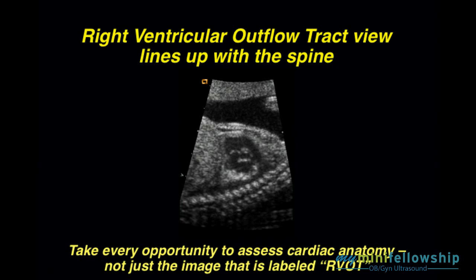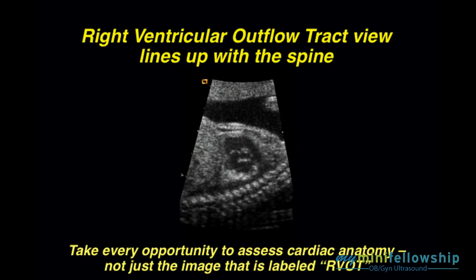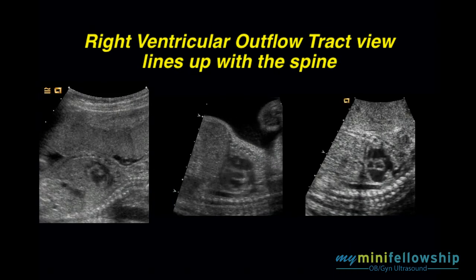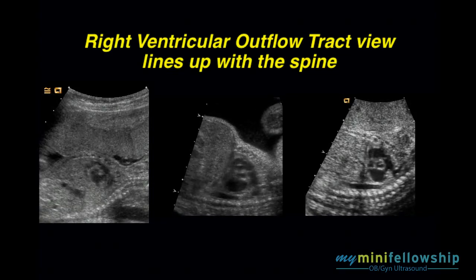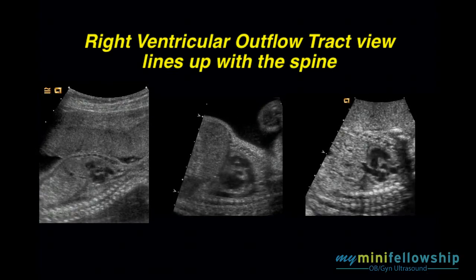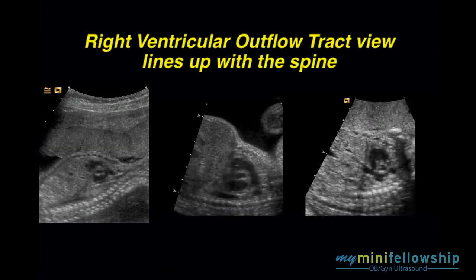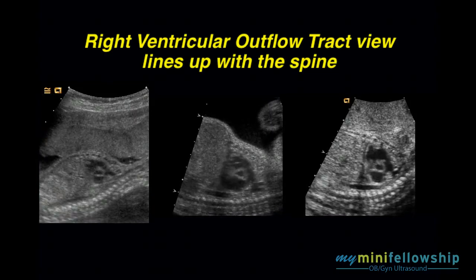Do not sit there waiting for the picture to show up that has RVOT inscribed on it. Every time you have an opportunity to evaluate the heart and the great arteries, take that opportunity. Take a look and see if anything doesn't look quite right. Here, we're looking at three cine clips. What I want you to do is look at the thoracic spine, and when the thoracic spine looks the best to you, look up at the heart and see what you see. In each instance, you will see that when the thoracic spine is lined up, you have pretty close to a perfect RVOT view — certainly good enough to make all of the observations that we wanted to make.